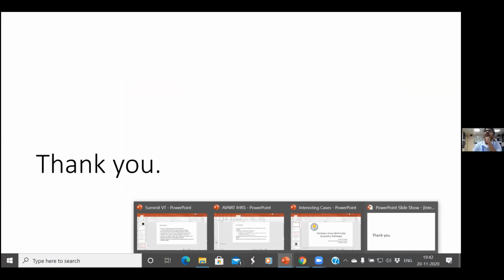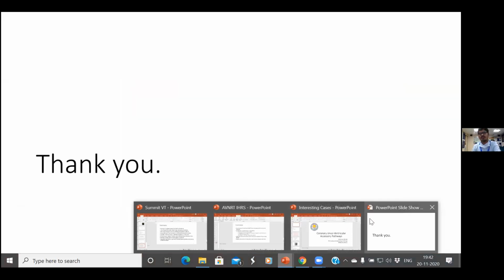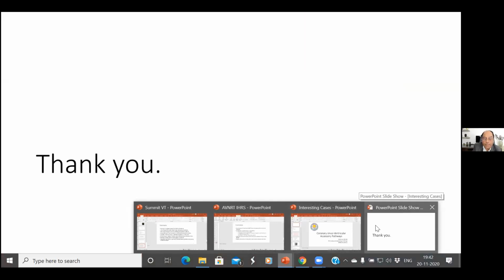So at least we have never had to take an epicardial route to ablate these pathways. We've never had to do that on the left side, because it's usually along the proximal CS diverticulum or along the tributaries. So at least on the left side, we have not found it necessary. Usually they can be ablated at the origin, at the insertion of the tributaries. You don't have to go into the veins usually.